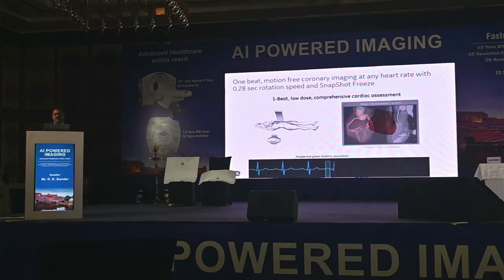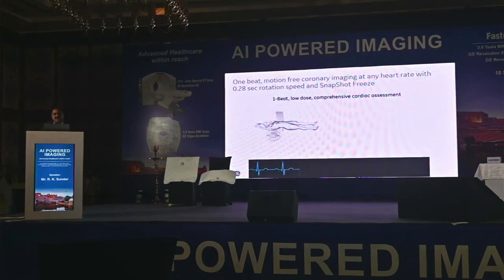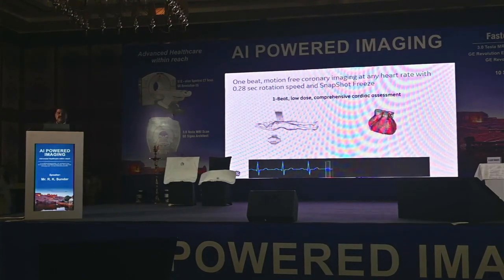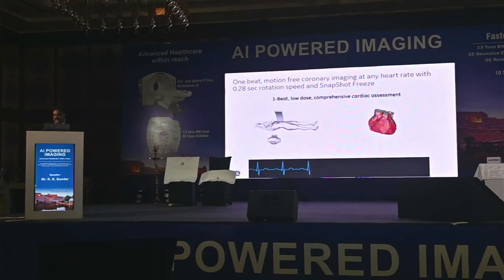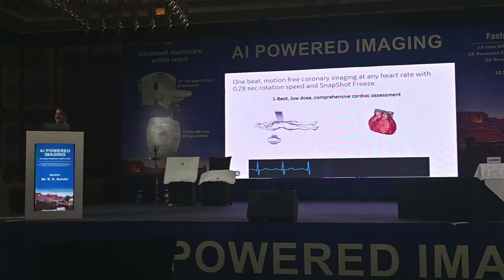So hyperlipidemia, diabetes, family history, these are all the indications of having a cardiac CT done. It is a simple screening procedure. Of course, it involves use of contrast media, but at very low radiation doses, almost 1/6 the dose of normal coronary angiogram in cath lab.